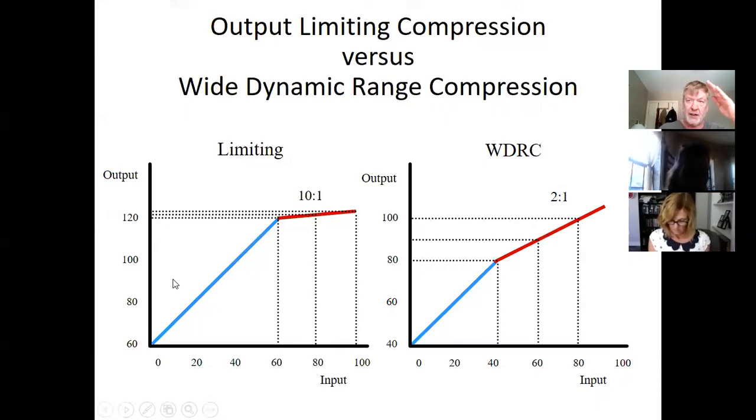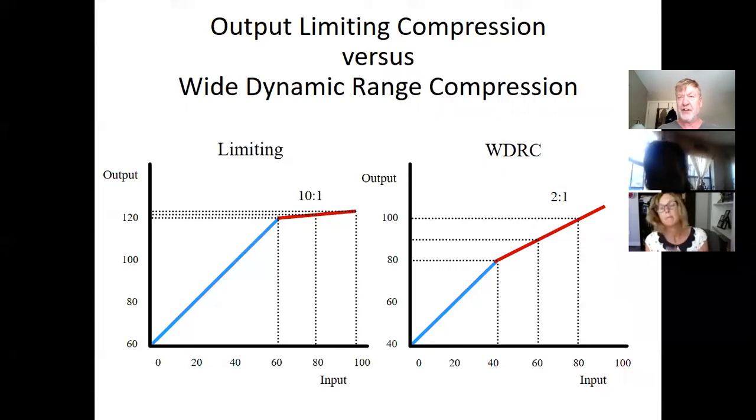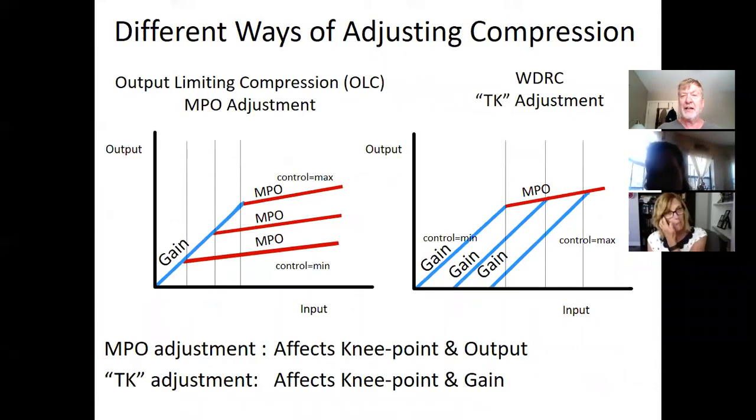The diagonal line to the left or right shows a gain change, but the length of the line doesn't have anything to do with the amount of gain, because here 0 in is 60 out, 20 in is 80 out, 40 in is 100 out, 60 in is 120 out. The differences are 60 for all of those numbers I just mentioned. So the length of the gain line has diddly to do with the amount of the gain. It's a question that I commonly ask, though, because a lot of people get mixed up about that. I don't know why, but anyway, here we go.